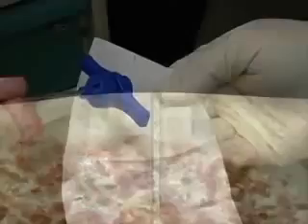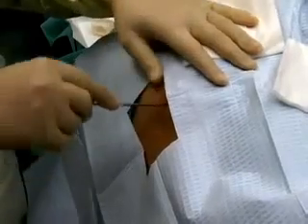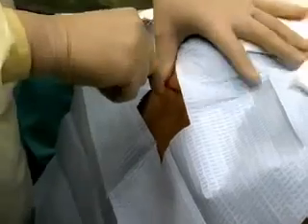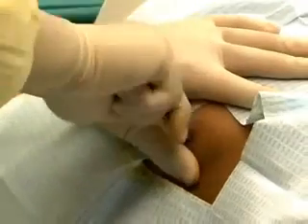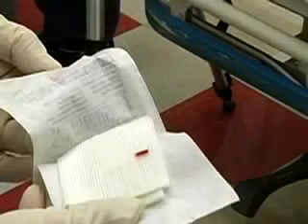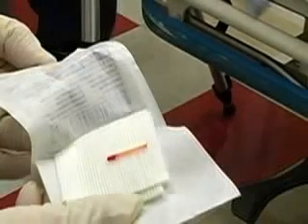Removal of the biopsy needle without breaking off the core specimen is a common problem. In this case, reinsert the biopsy needle, ensure that the specimen has been detached from the surrounding marrow before removing the needle, and be sure to remove the biopsy needle slowly while continuing to rotate. If the core specimen is too small or contains too much cortex and too little marrow, consider obtaining an additional biopsy specimen.